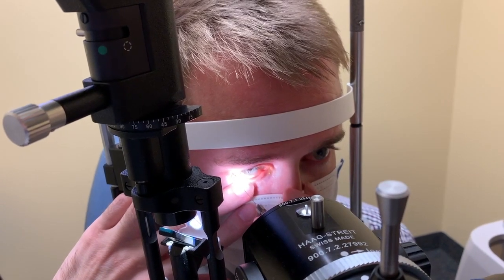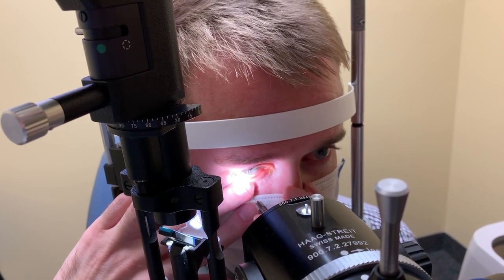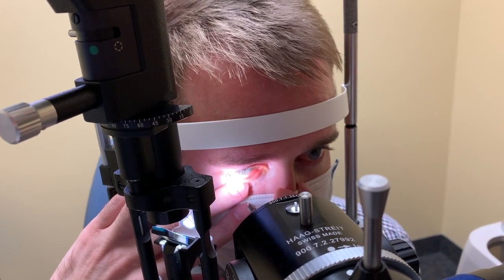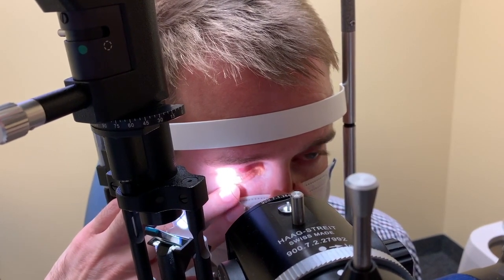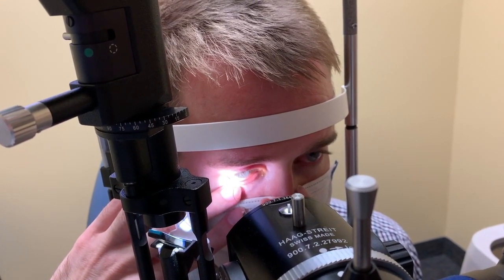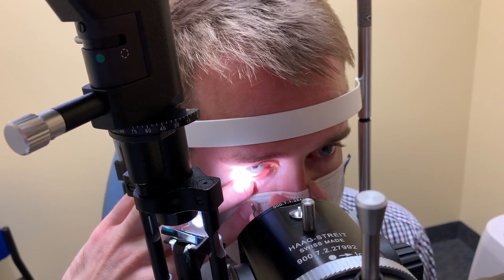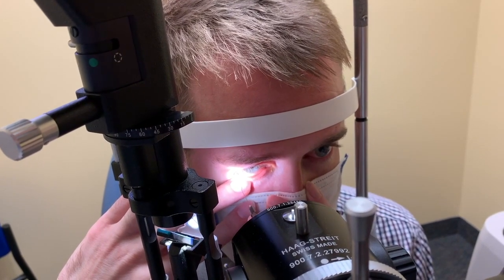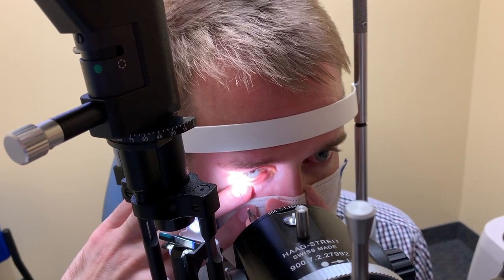You can use a cream to achieve some numbing effect, however you have to wait for the cream to work for several minutes before you can do anything, and even then the sensation will not be completely gone. Most of my patients I have only used proparacaine drops.